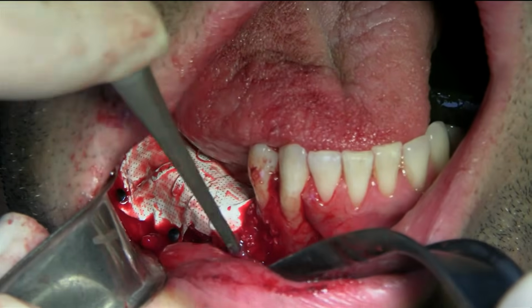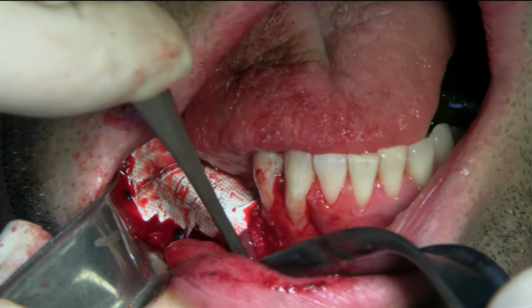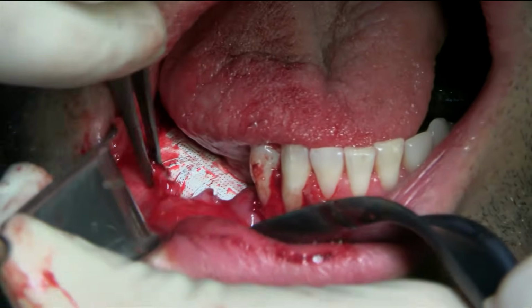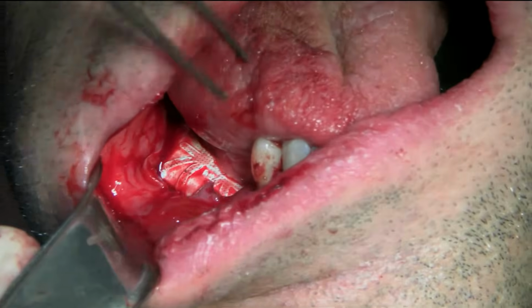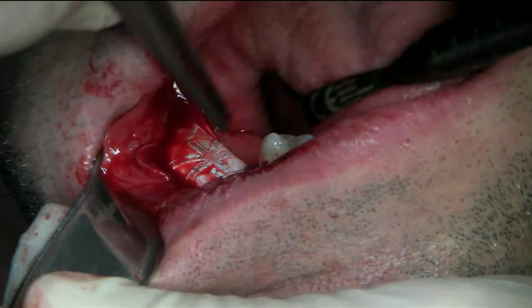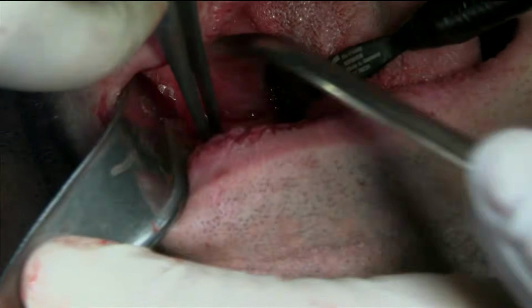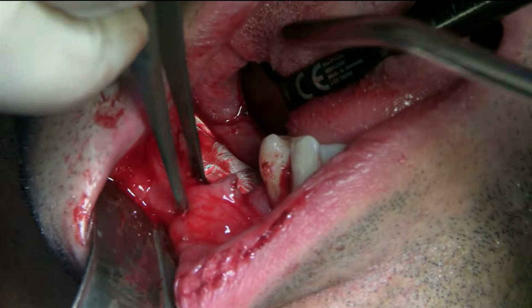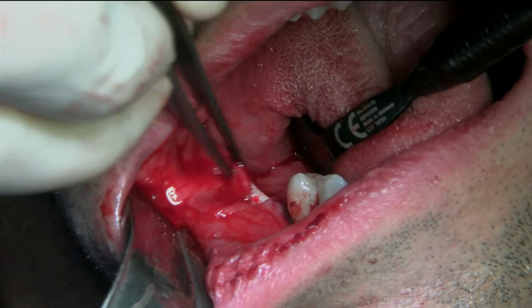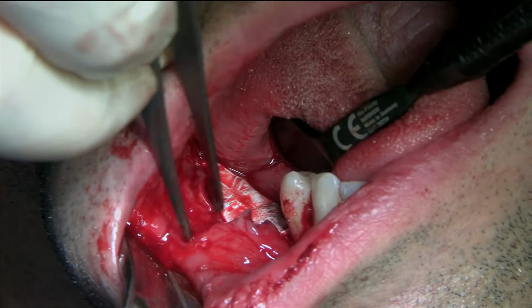Okay, I'm going back again here. Now let's see how the flap will close. You need to retract the lingual. Okay, you can see the buccal. That's good. Oops. Yeah, we're going to give you a little bit more anesthetic. So here's, this is closing. It's closing.